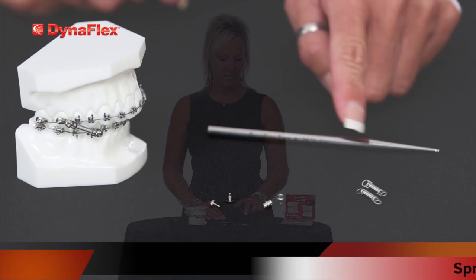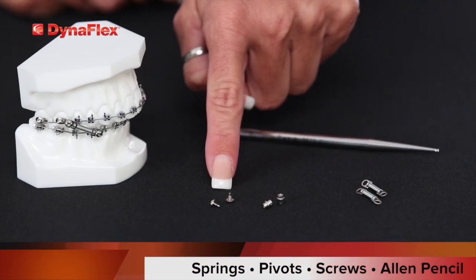In your kit, you will receive springs, pivots, screws, and an Allen pencil.